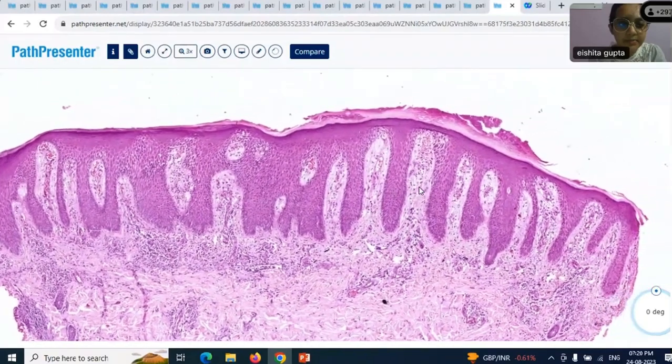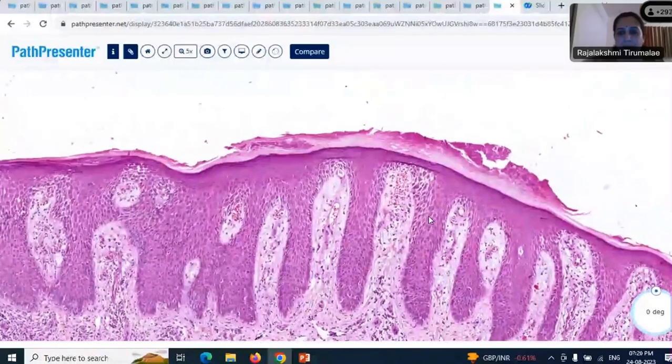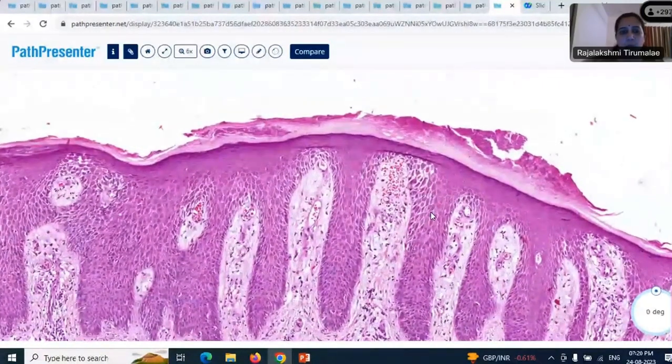Okay. Then, so you described all the findings. So now, after having described the pattern, can we look at what's happening in the stratum corneum? Are there some clues here?